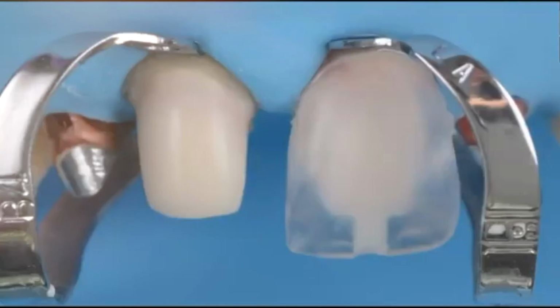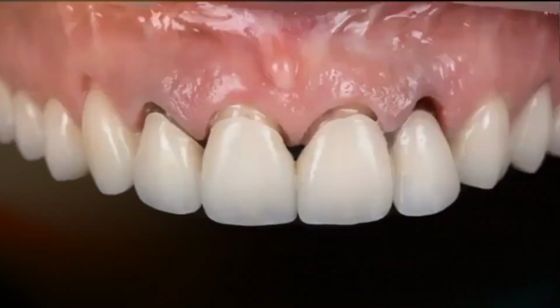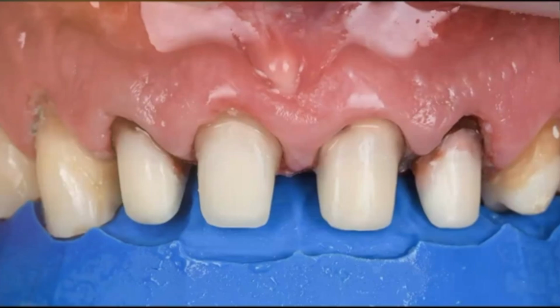Then when you cut this off, because you're not going to be able to remove it, you're going to have like a beautiful abutment according to your final design, which otherwise for me with my hands is a lot more difficult to do freehand, because you build it up, then you have bubbles, then you add, you remove. It's not easy. And you can see this is what I want ideally according to my final design. This is the silicone guide for my finals. And then you can see I only solved part of the problem, because I was able to block the centrals, but the laterals still in the area of ferrule, I still have like dark.